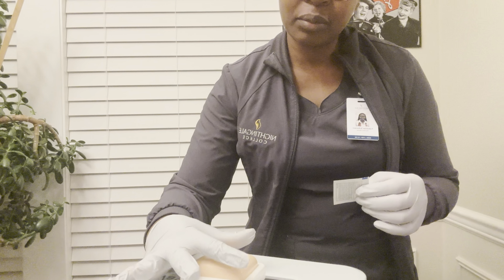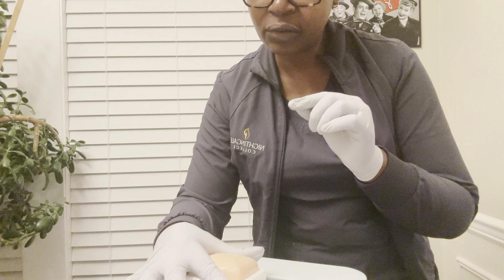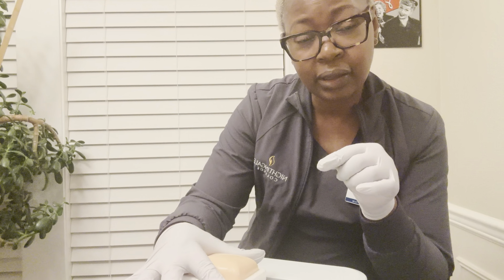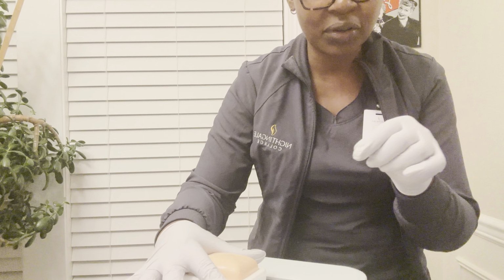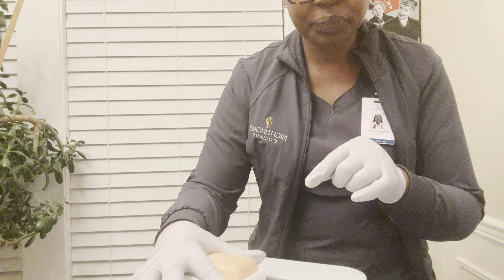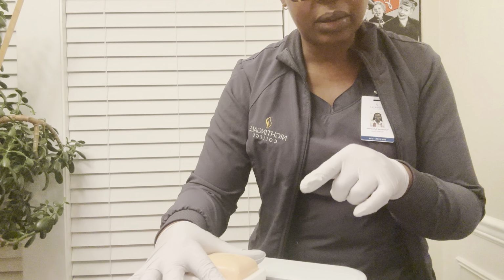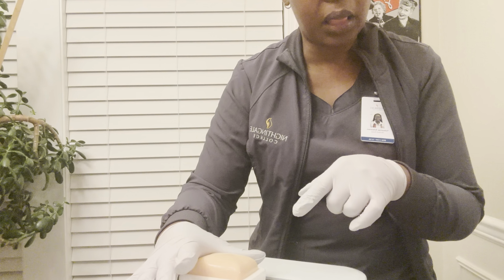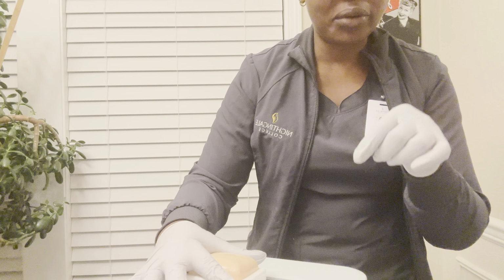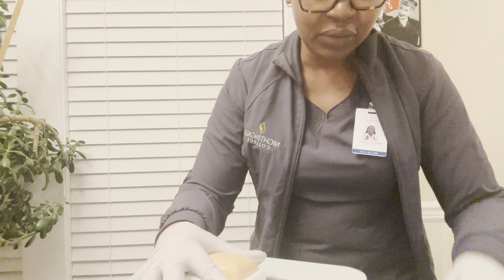I will press it like that, and I'll try to identify the V. That's where I'm going to be doing my injection. So on the trochanter of the hip, that's how I'm going to identify the V on where I'm going to be injecting. So I have pointed out where I need to inject my medication.